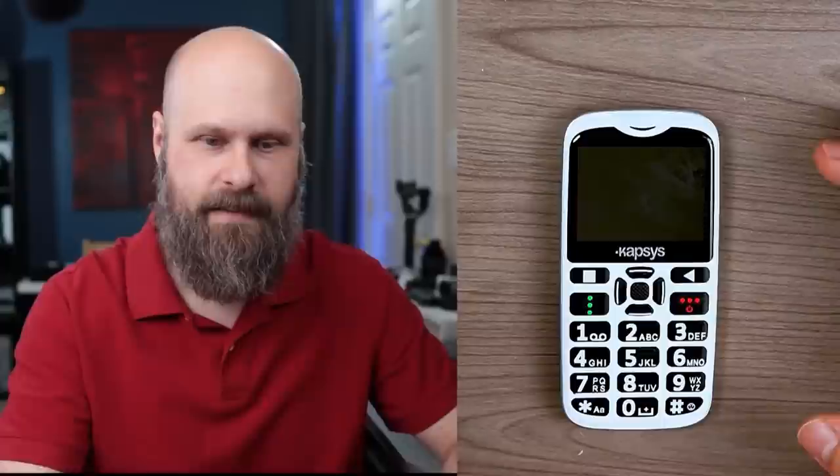The front of the phone consists of two elements: the upper half is the screen, and the bottom half is the buttons and keypad, as well as the menu and navigational buttons. The top of the phone has an LED for the flashlight. The bottom has the micro-USB port for charging, as well as the headphone port — a 3.5 millimeter headphone jack. On the back of the phone, you have the camera, the SOS button, and the speaker grill where voice audio comes out.